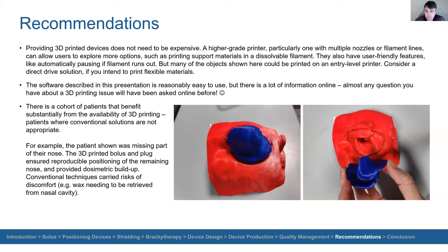But I would say that basically most of the objects that have been shown here can be printed on a fairly cheap entry-level printer. I would say if you do want to print a flexible material, do look at a direct drive solution, and that is that the gear that extrudes the filament or pulls the filament through the print head is as close as possible to the nozzle through which the filament is extruded.